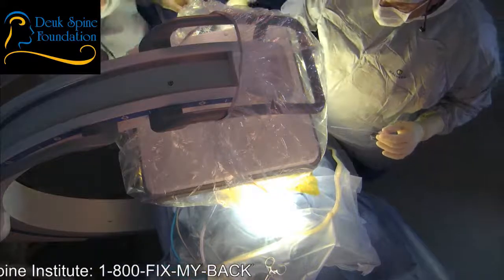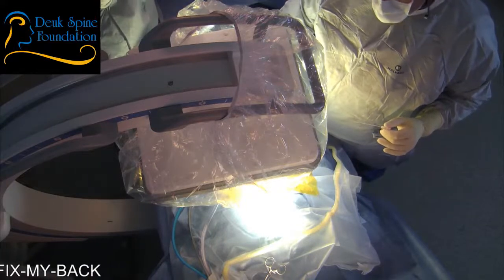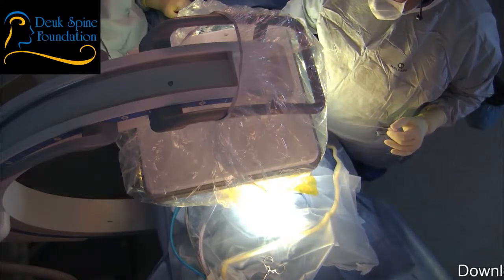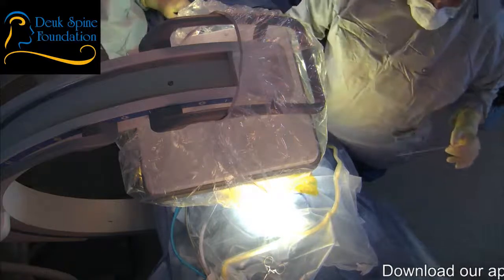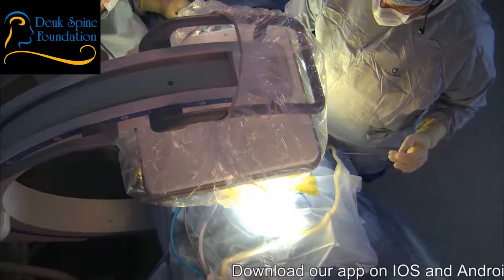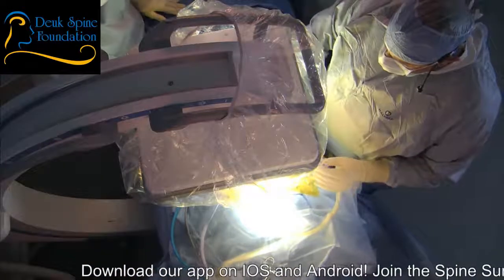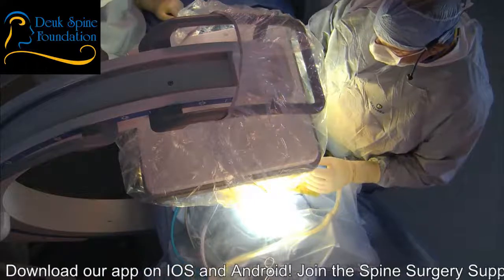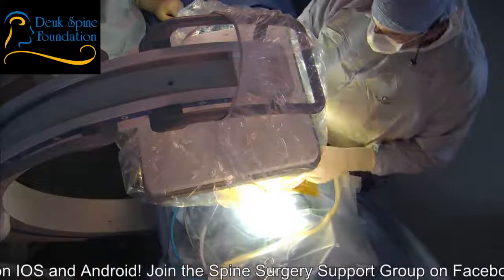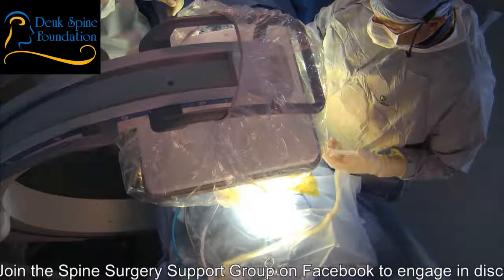All right. Are you comfortable where you are? He's uncomfortable? What's wrong? How can we make you more comfortable? Something under your ankle? Oh, you feel something squeezing your leg? That's a leg squeezer. That's to keep the blood circulating up your leg. So not much I can do about that. We'll try to get this done and get you asleep as soon as possible, okay? All right, so just bear with me. Remember, if you feel a lot of discomfort, you just say, ouch. And I'm going to do my best to give you some more numbing medicine and make it better, okay?